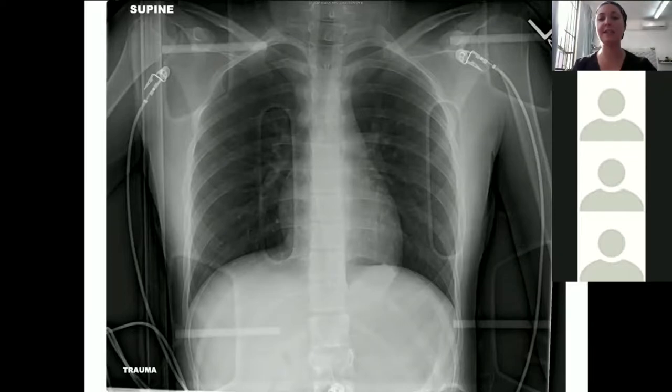You want to have a look and see, is there any sign of trauma somewhere? Interestingly, if you have a look down quite nicely here and you go through all the bones systematically, this x-ray is a little bit over-penetrated, overexposed, because you can see your T-spine all the way down. But if you have a look, can you see that your vertebrae here are all nice and square? And this vertebra here has collapsed a bit. So if we know it's a trauma patient and your patient's on a spinal board, I'm worried about what trauma is going on with that vertebra that's collapsed right down towards the bottom part of that x-ray.